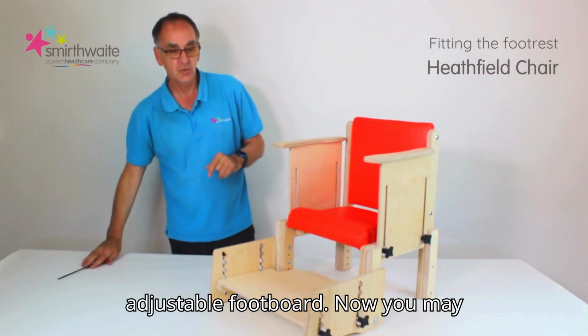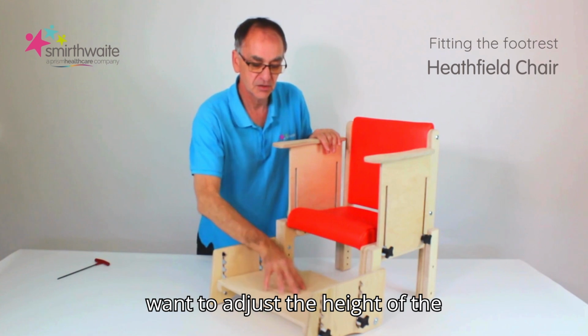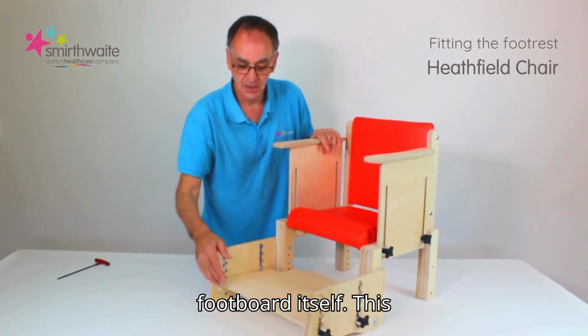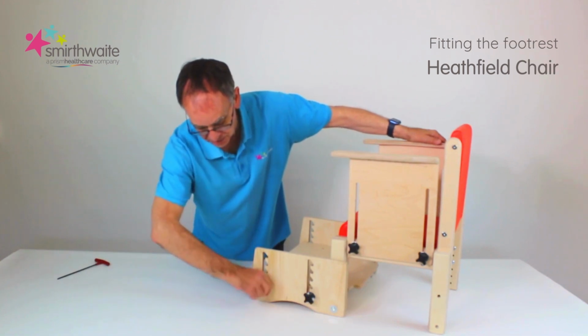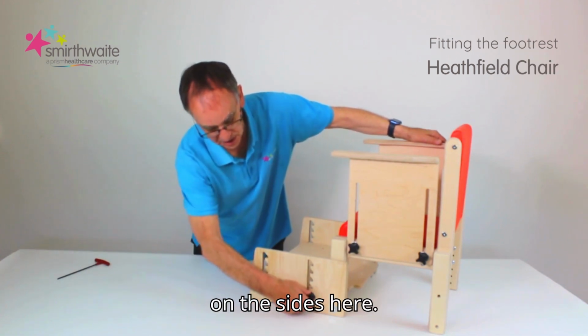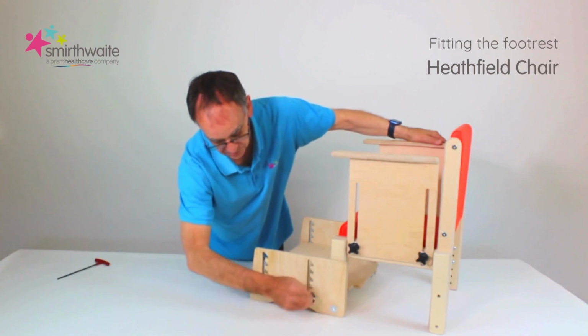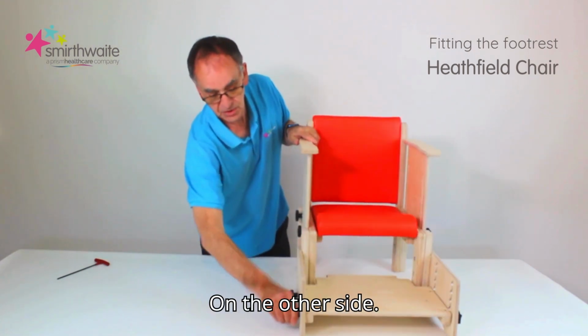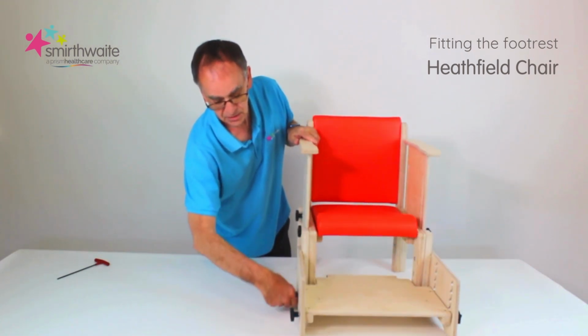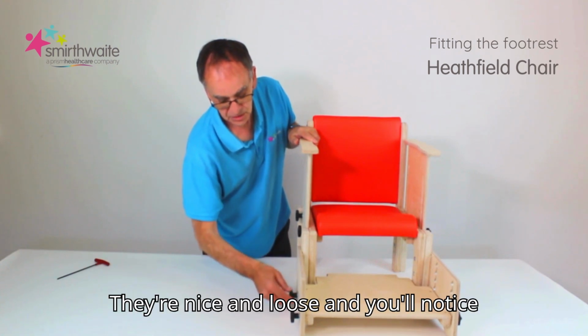Now, you may want to adjust the height of the footboard itself. This can be done by loosening the hand wheels on the sides here. Nice and loose, and do the same on the other side. So they're nice and loose.